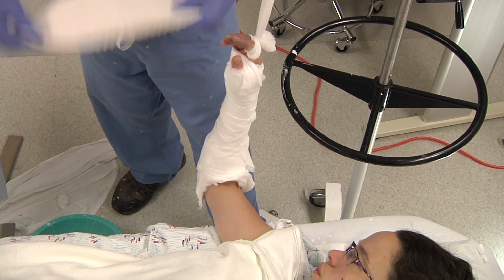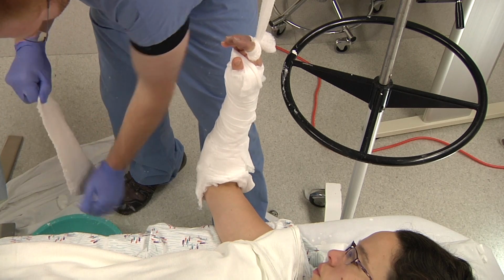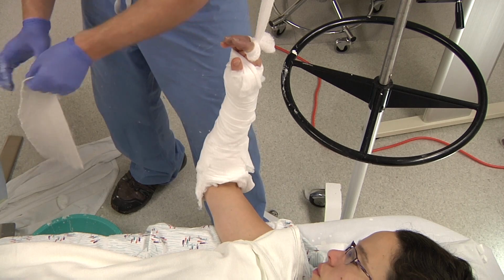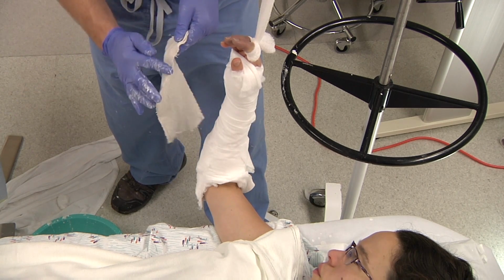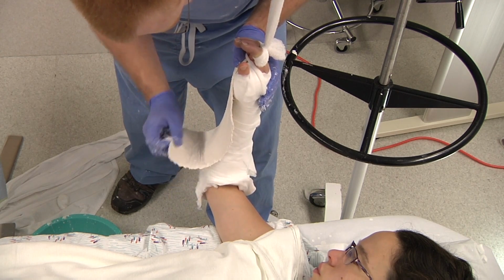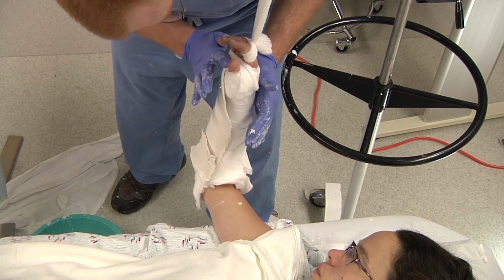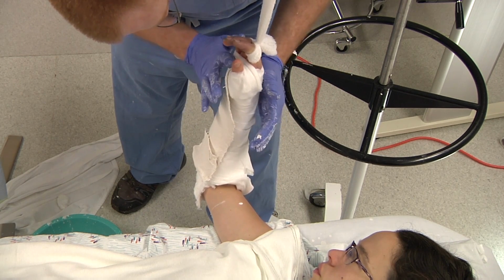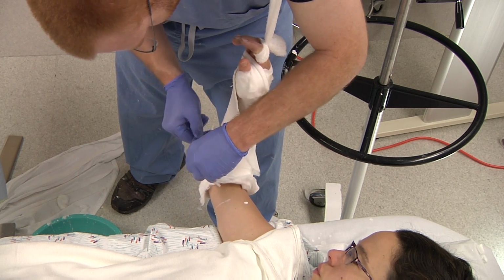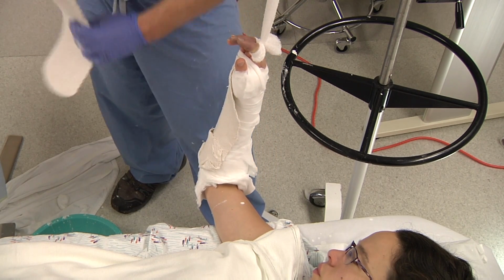Next, we take our plaster, dip it, laminate. Make sure to laminate very well. We have our one that we specially cut that has a little bit of a thumb recess. That goes up. You can fold it back if you need to. You want to make sure you end at the level of the metacarpal heads. Try to bend back any hard corners so they don't become hard and sharp and poke into the skin.